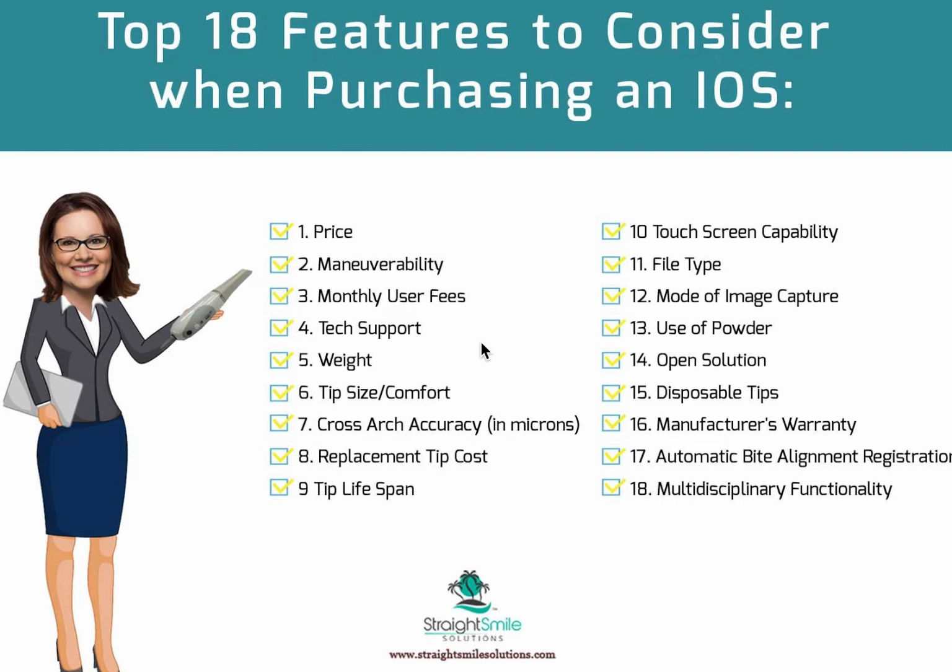You know, you got to be OSHA compatible. Touch screen capability, that is a pet peeve of mine because I've certainly done a lot, as you know, a lot of secret shopping to some of these scan shops, direct-to-consumer scan shops, and that grosses me out when they do not respect OSHA with a touch screen. That's nasty. I see it all the time. So make sure your team members are following OSHA standards.